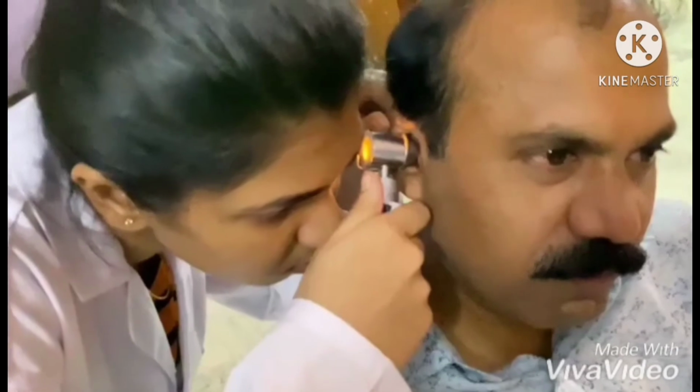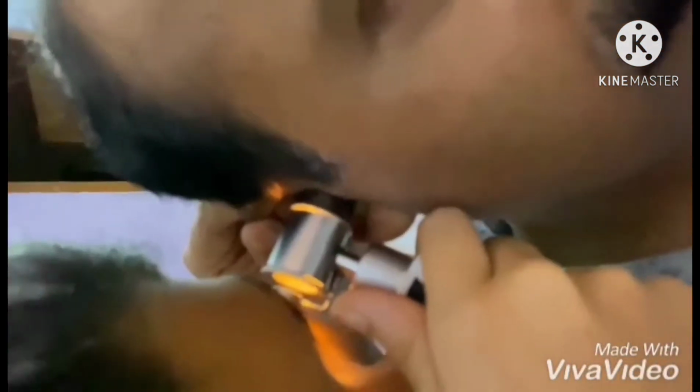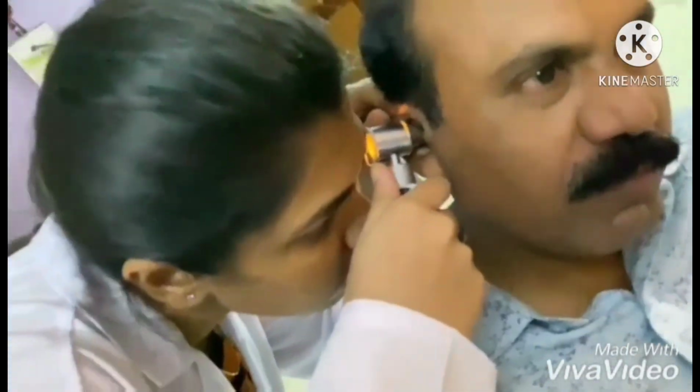Insert the speculum gently into the ear canal, directing it downward and forward, and then inspect the ear canal and the eardrum.